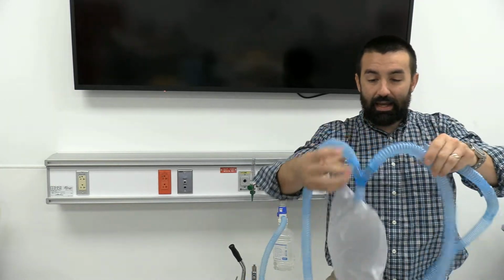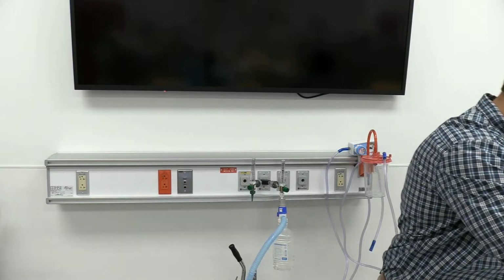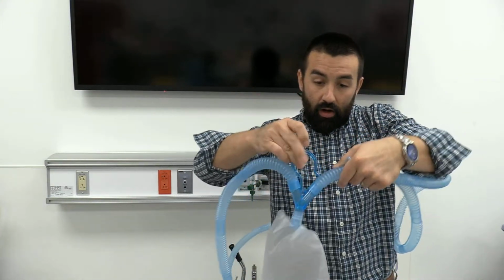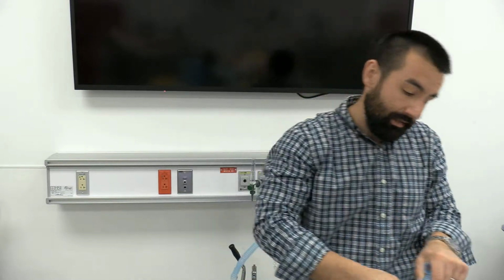Now these drain bags, you don't want to go through all the trouble of putting a drain bag to collect condensate and then just throwing it on the ground and the thing being upside down and bubbling in your circuit, okay? So most of these come with a hook design, and you can clip it into the lowest point in the system, so you can clip it to the bed rail or something like that.